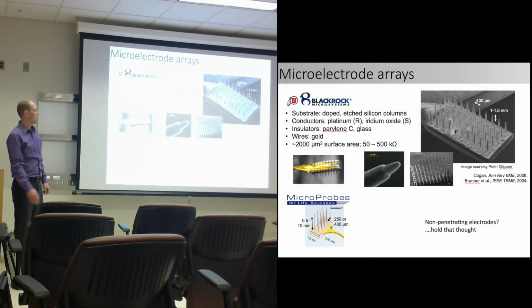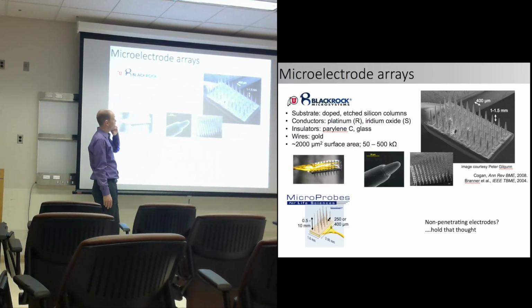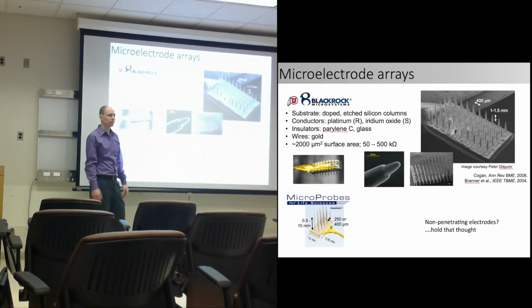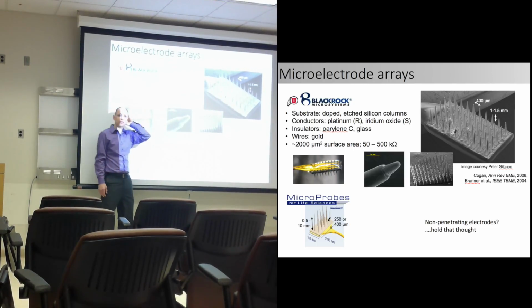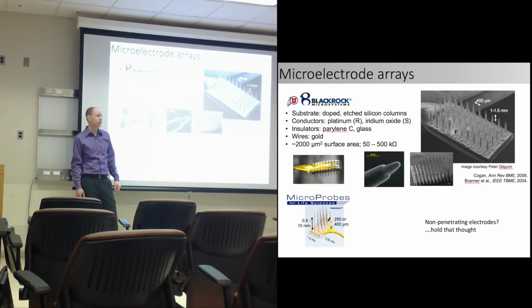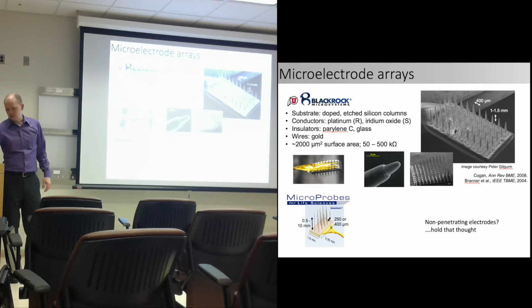Just briefly, I'll comment on the electrodes we use, something that was developed and came out of the University of Utah, where similar technologies are used to make the microprocessors in phones and computers. It is silicon-based electrode technology with some active elements to it. Originally, these electrodes were designed to be put in the visual cortex for visual prosthesis, and they've moved on to the brain computer interface I mentioned before, the same type of implant that's put in the cortex. And there are some other versions that they're developing.